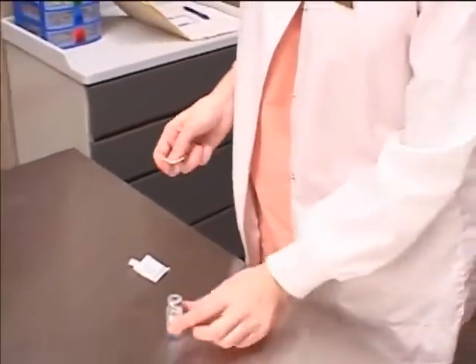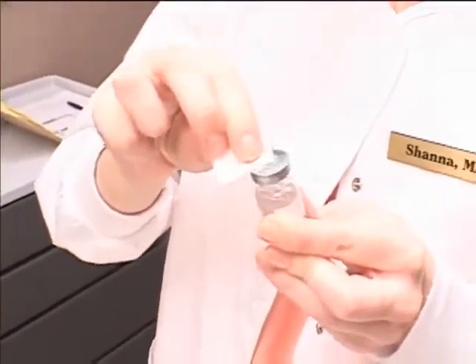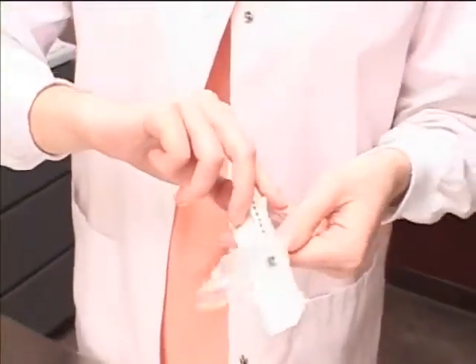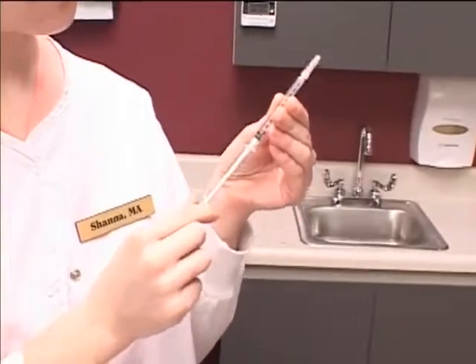Clean the rubber top of the vial with an alcohol pad. Use a circular motion starting at the center and working outward. Open the syringe and needle. Be careful not to contaminate the items when opening. Loosen the barrel of the syringe by gently pulling the plunger back and forth.